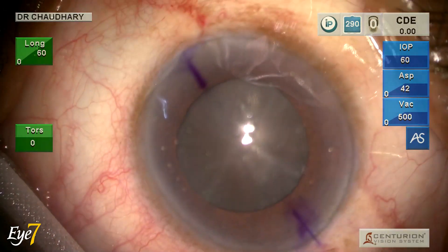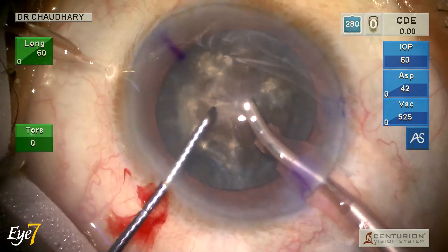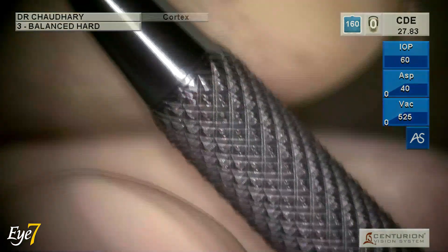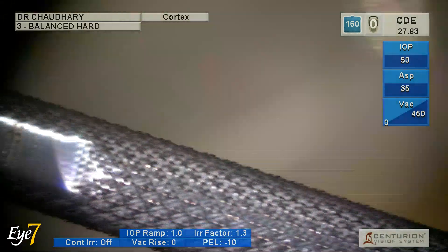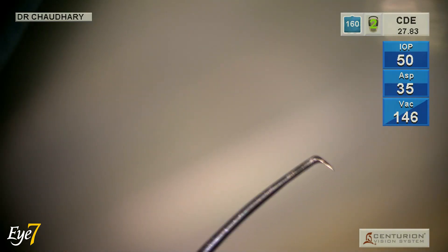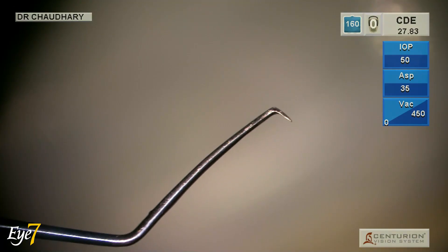This is the cataract which is the challenge, and my tool is a Centurion Phaco machine with a balance tip and a long and short chopper. The long tip is 1.6 mm, the short tip is 1.35 mm, and with this I am going to handle this nasty black cataract.